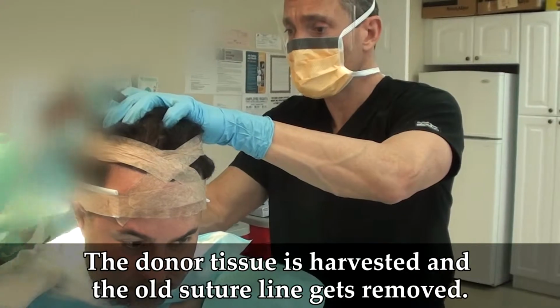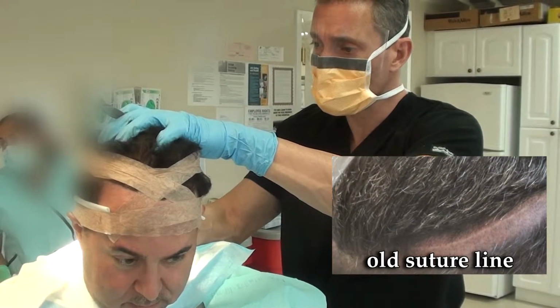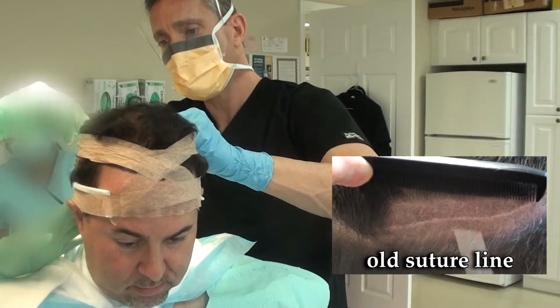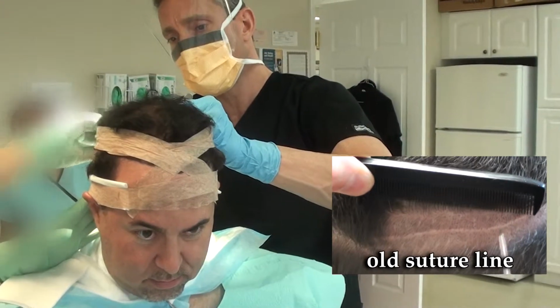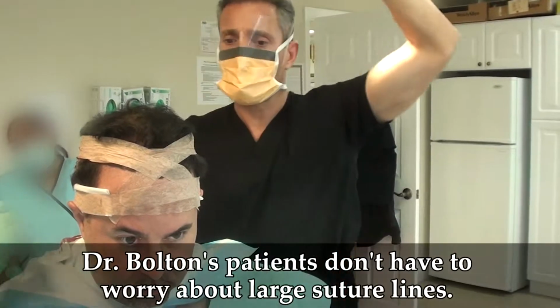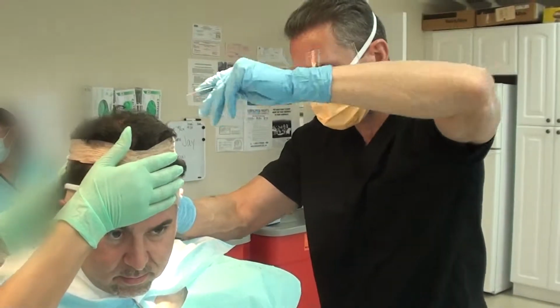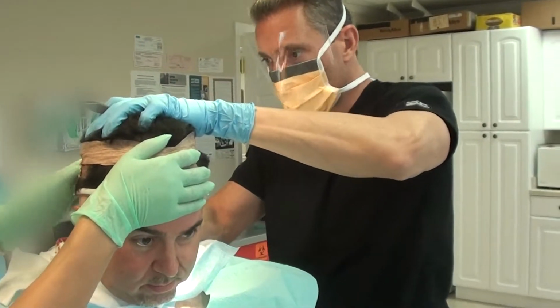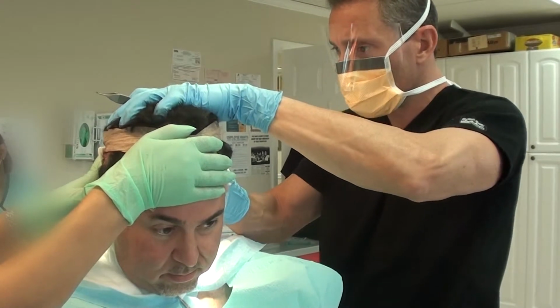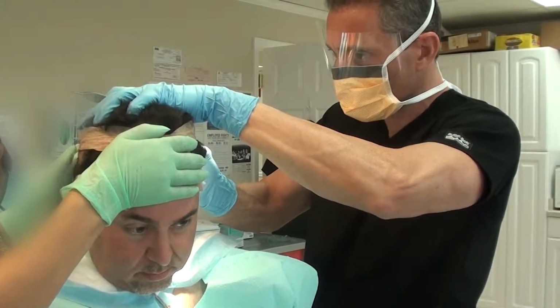Right now what we're doing is we're harvesting the donor tissue. We're excising the old suture line, so that way we're going to leave Jay with just the one suture line. So even though it was a great suture line, we're going to remove it. That way if Jay chooses to cut his hair short, he'll just have the one trace line, which a lot of the guys today are so concerned about. For the life of me I don't understand why, but I get it. But at any rate, all we're doing is just harvesting the donor right now.